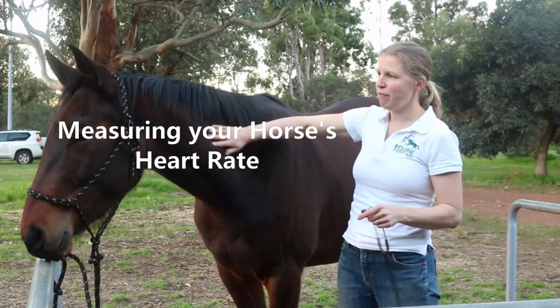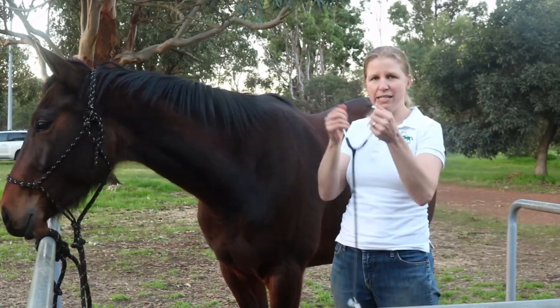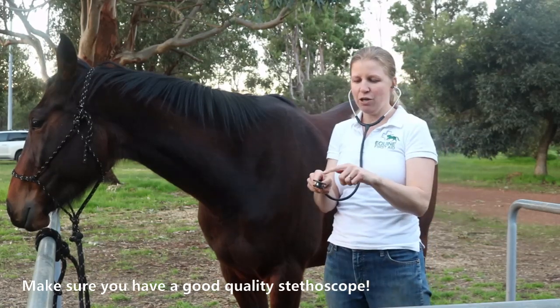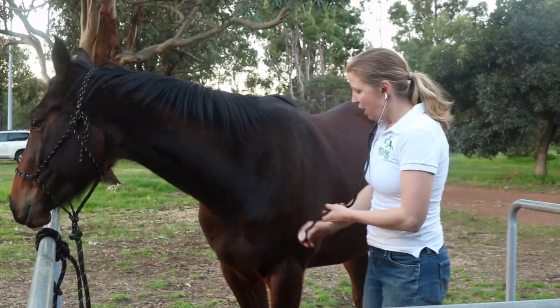I'm going to take Maverick's heart rate. I'll put the earpiece of my stethoscope into my ears pointing forwards, and make sure that my stethoscope is on — I can hear a sound when I gently tap on the bell.